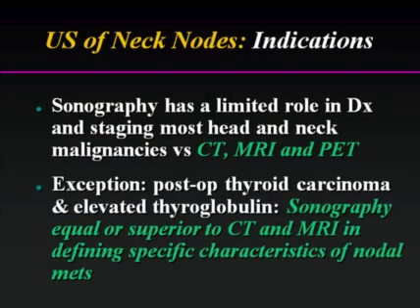For the most part, the main evaluation of cervical lymphadenopathy relates to head and neck oncology. And I think it's fair to say that sonography has a relatively limited role in staging most head and neck cancers. Current state-of-the-art CT, MR, and PET are used primarily for many head and neck carcinomas, many of which are squamous cell carcinomas. The exception to this is in the patient with thyroid cancer. And here sonography is equal or superior to CT and MR in defining many of the characteristics of nodal disease.